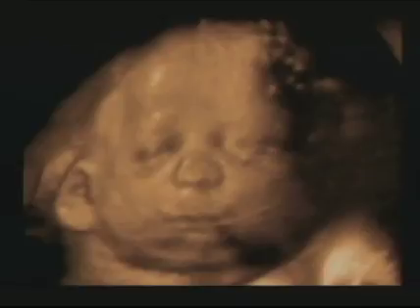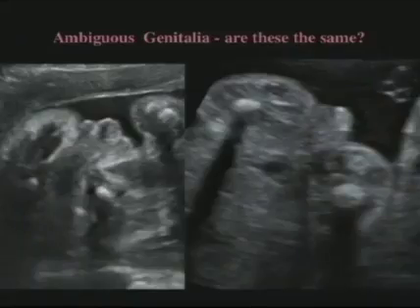This fetus has a funny ear as well, but it also has hypotelorism. The eyes are too close together and the chin is very small. These are dysmorphic changes that we used to have a hard time discerning with 2D ultrasound. But now with 3D, we can display them almost as well as they are displayed later when the baby is born.